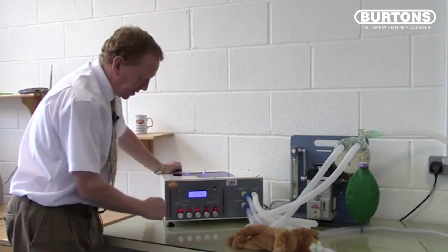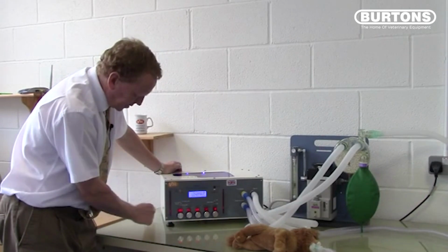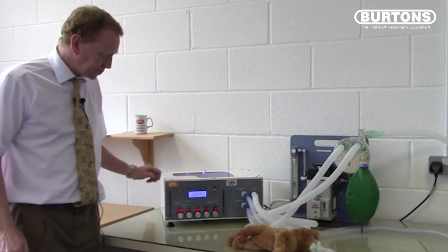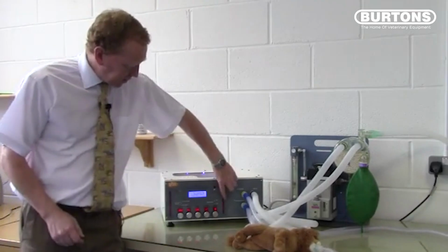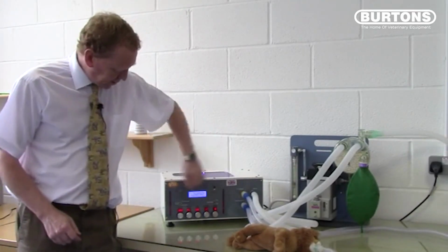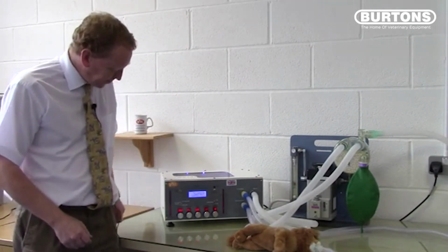Again, sigh mode is off. This is in the flow position, and now we hit run. We'll see that Leo's chest is inflating just as before. The airway pressure is getting up to about just under 15 here, as we see by the rough guide from the bar graph gauges.